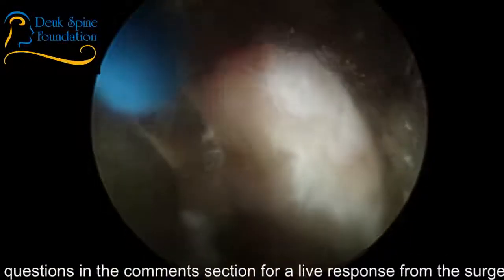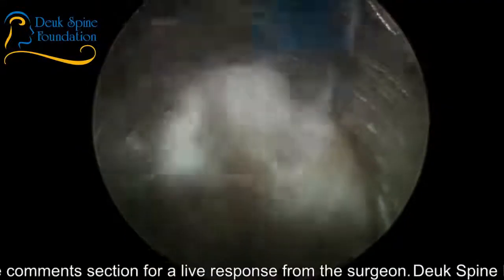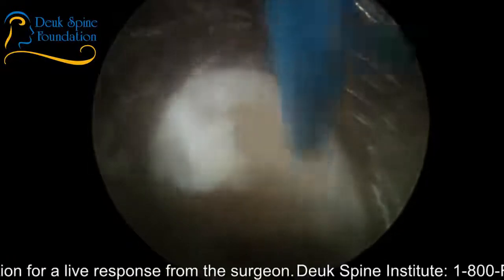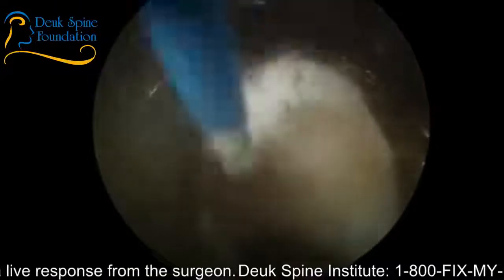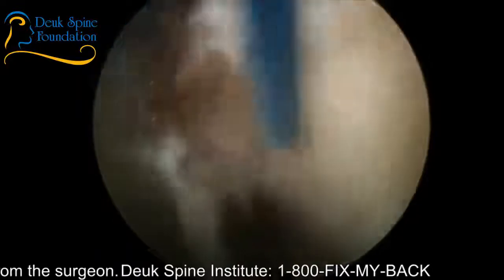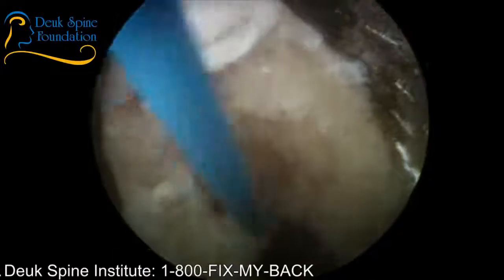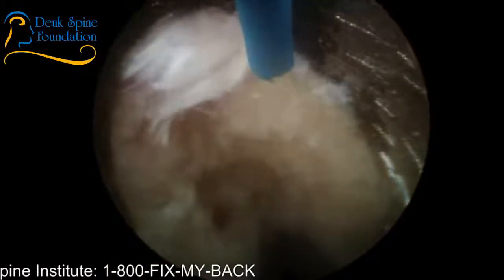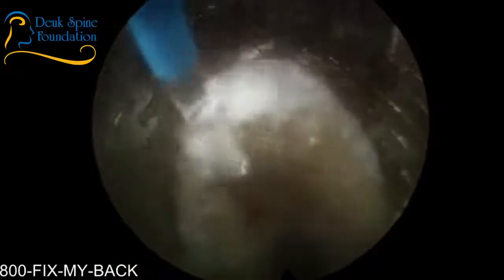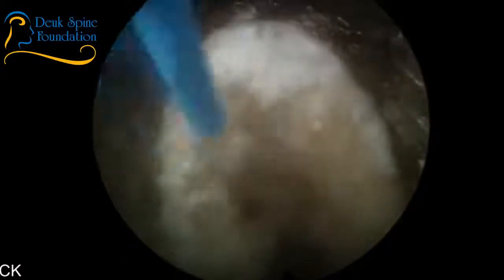Let go. No, I wanted you to hold this here. Hold this. Yeah. Thank you. Now with a listhesis, you're inside the disc, but you could very easily become outside the disc very quickly. Why? Because when you have two bones lined up perfectly, you know where the disc is. It's easy to find. But once those bones start slipping on each other, then it's not so easy to find the disc anymore because the disc gets stretched.